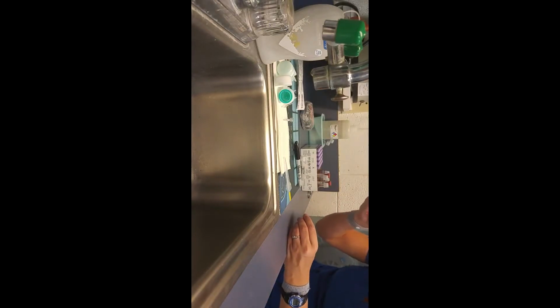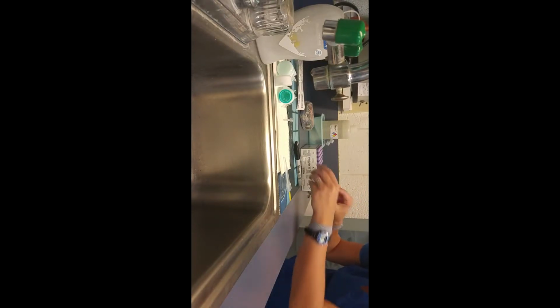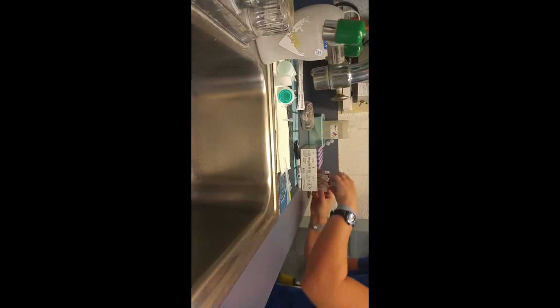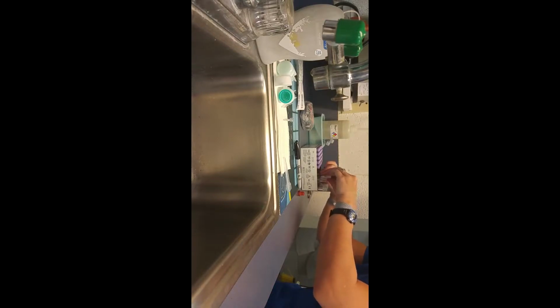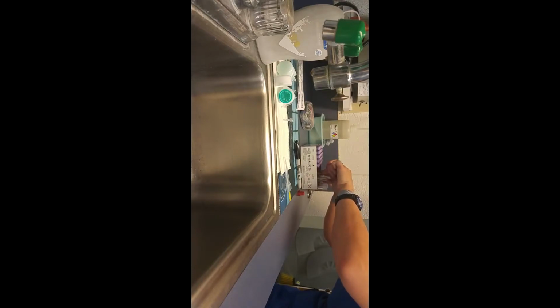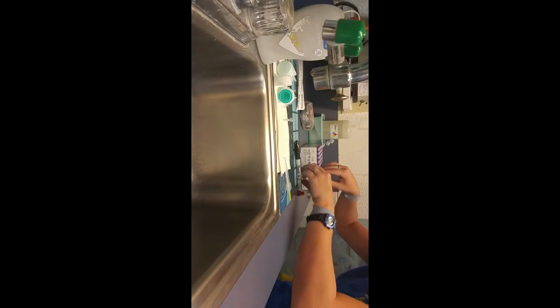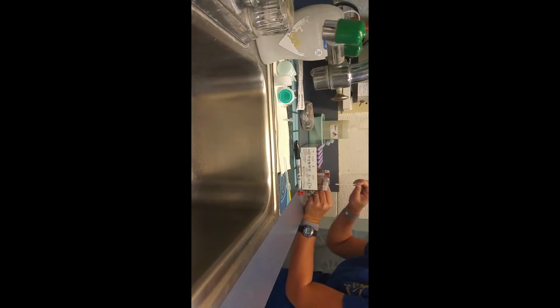I've got the recipient serum and the donor's cell wash in here, and I'm going to do kind of the opposite in this test tube here. Take two drops of the donor serum and then two drops of the recipient's cell wash, or washed red blood cells. There, so I don't get them confused.